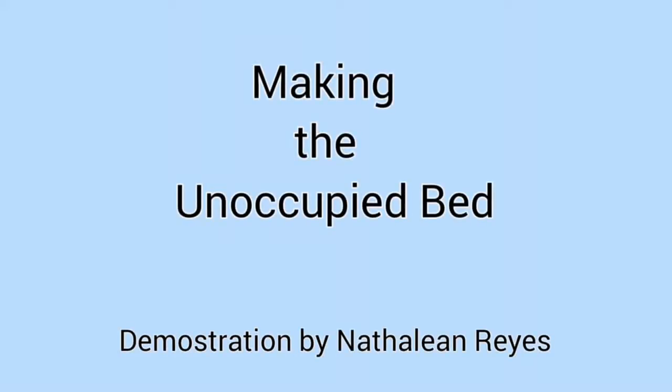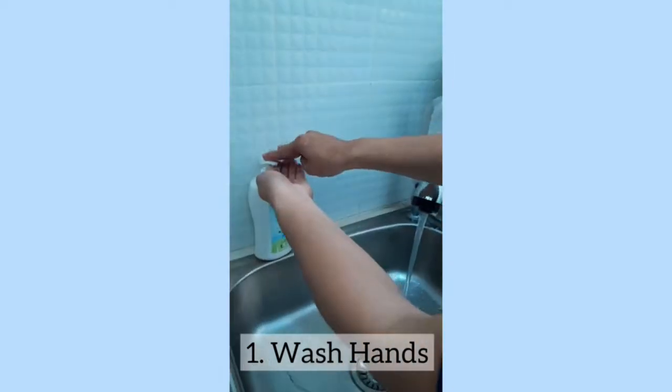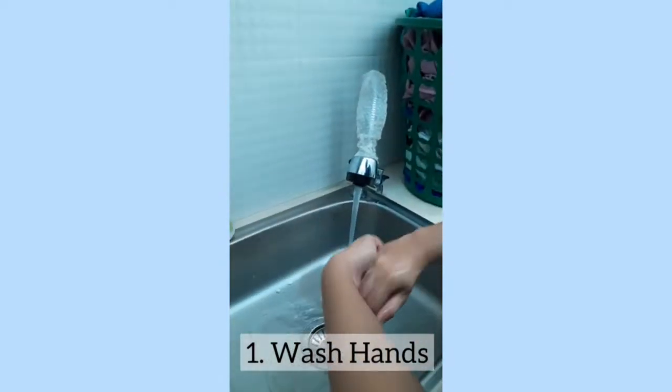Making the Unoccupied Bed. Step 1: Properly wash your hands before the procedure as appropriate.